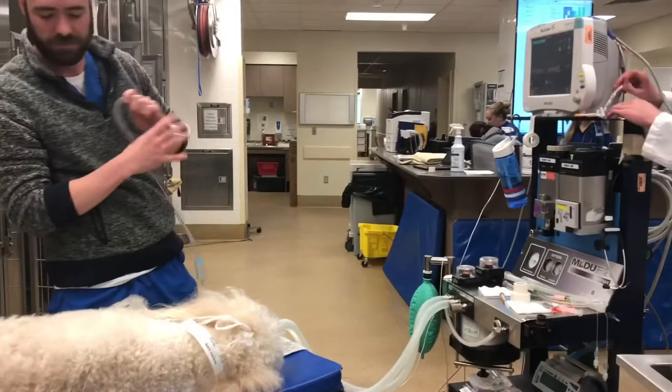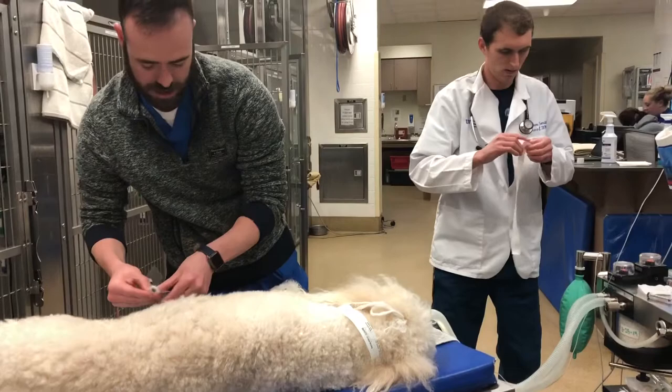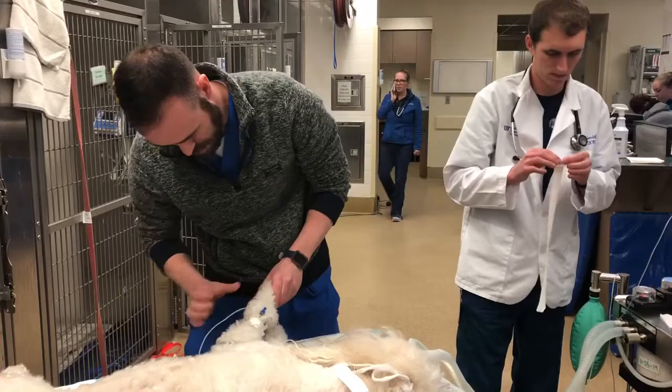The next thing is going to be the ECG leads. There's going to be three of those total. Two are going to go on the front paws, one is going to go on the back left, and you can also put one on the tip of the nose if you're not able to get to the back left. Heart rates are going to vary between species, but usually below 100 beats per minute in a cat is pretty abnormal, and below about 70 in a dog is something that you're going to want to do something about.